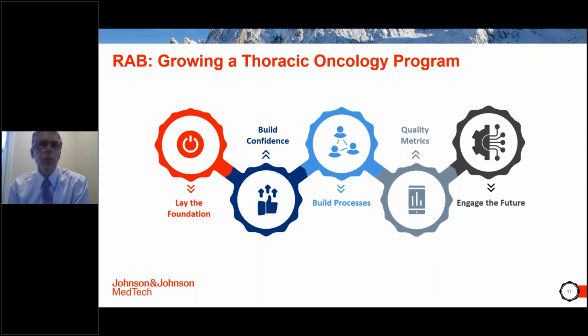And let me just sort of flesh that out for you a little bit. When our program started in December of 2020, we were doing approximately 290 CT-guided FNAs at our institution of lung nodules. And there really was not a realistic way to immediately disrupt that trend, because the process was in place for either primary care doctors or oncologists or radiation oncologists just to order the CT-FNA without necessarily taking into account the roles of other stakeholders. They would get the results of those biopsies and then make decisions after that of where to send the patient.